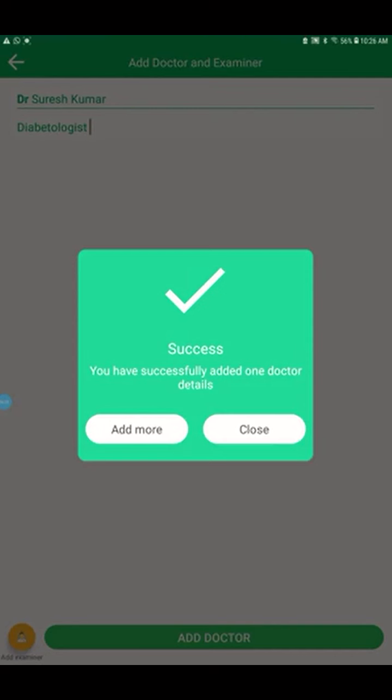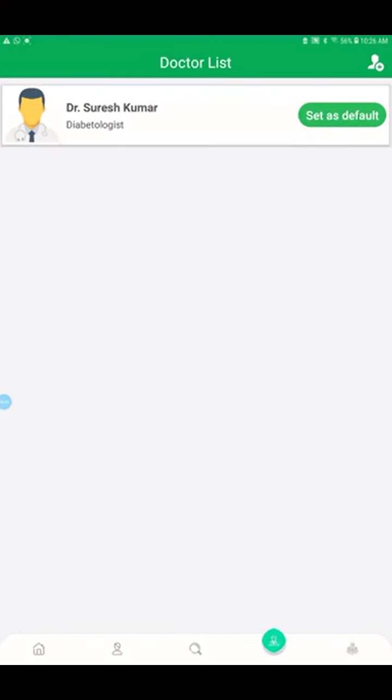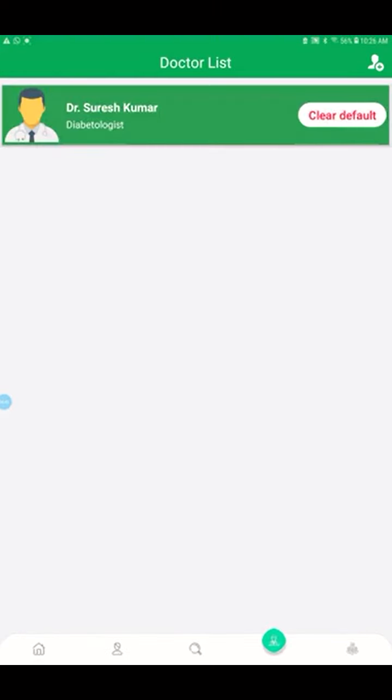If I have many consultants, like at Apollo, there will be many consultants, you can add all the consultant names. So when you do the test, the technician can select the doctor name. If it is a single user hospital, then we can close this. Okay, and again I can select this as a default, set as default. Once I set default, I don't have to select every time when I do the test, otherwise it will ask for the consultant name.